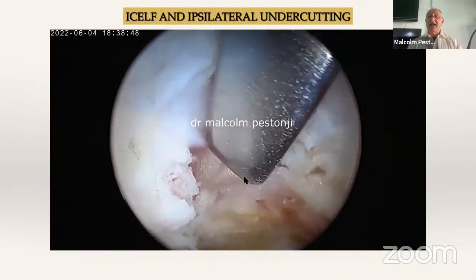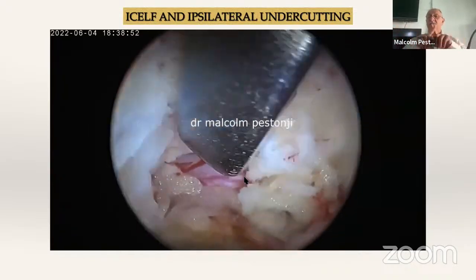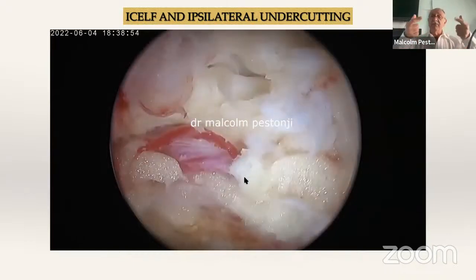Now I'm doing my ipsilateral decompression. So I can open up both the foramens. I can open up the flavum. I can see both the nerve roots that are exiting, both that are traversing, all four nerve roots very cleanly, keeping entire laminas intact. That is the key point. With other forms of surgery, you tend to be vertical. So you tend to do a little extra bone cutting, which here you can go sublaminar over the flavum into the contralateral foramen without even touching the laminar edge.